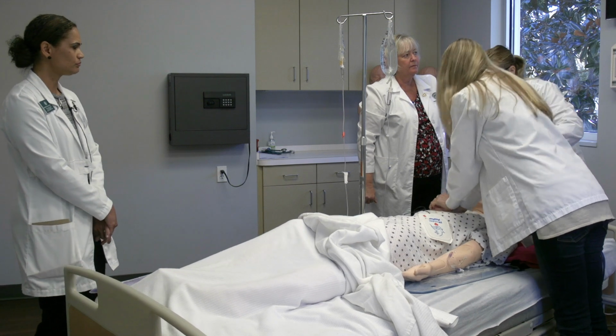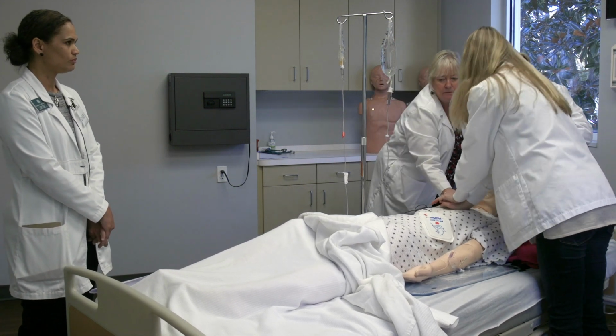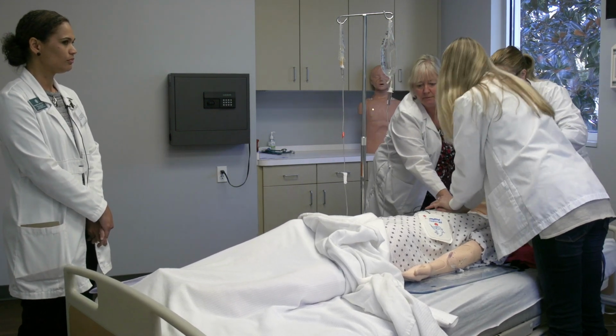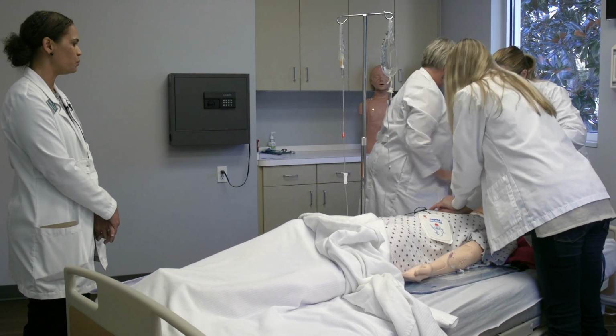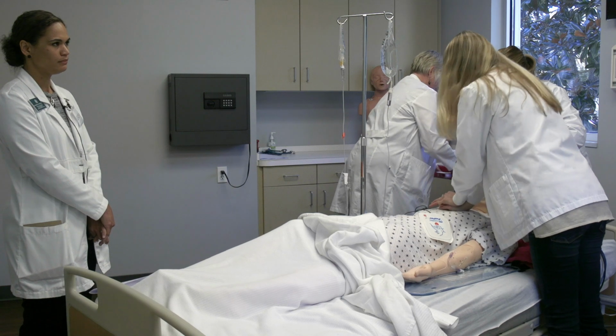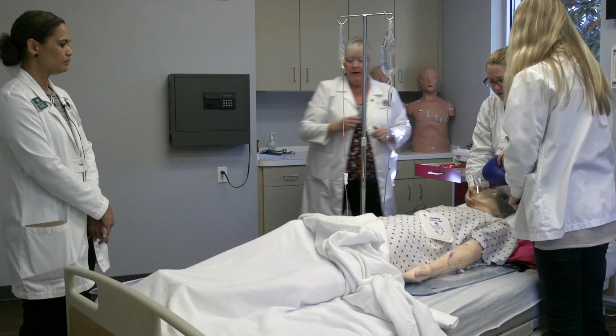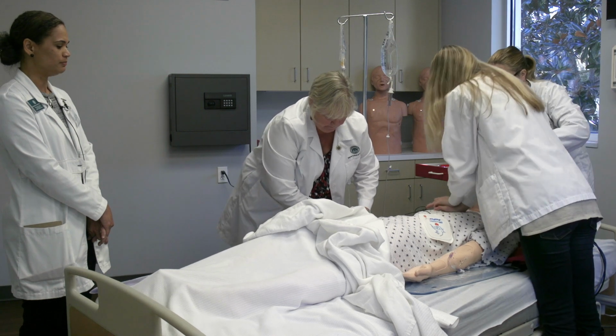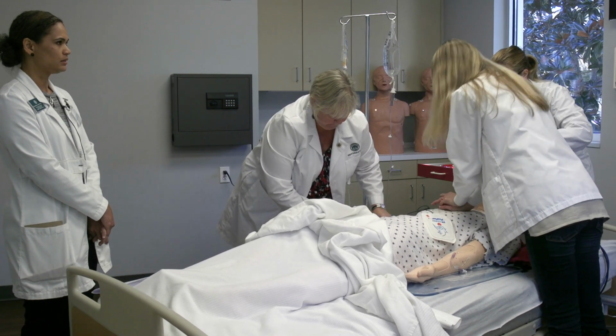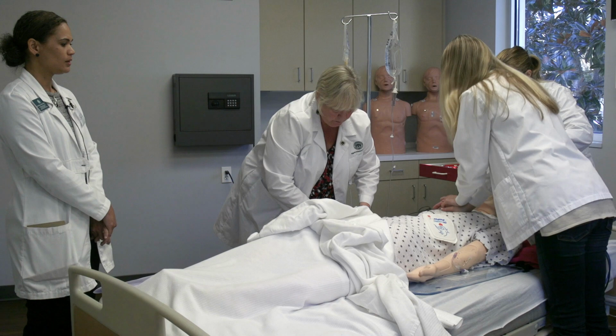No change in rhythm. No pulse. Ventricular fibrillation, we can go to medication. We're going to do epinephrine 1 milligram. Epi 1 milligram. We can give this medication every 3 to 5 minutes with no maximum. Epi delivered with a flush.